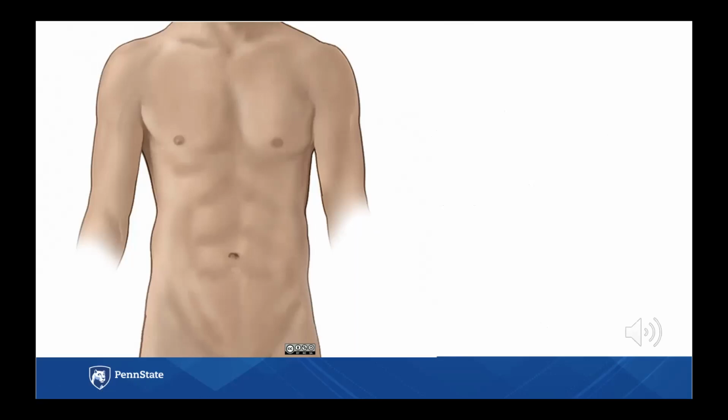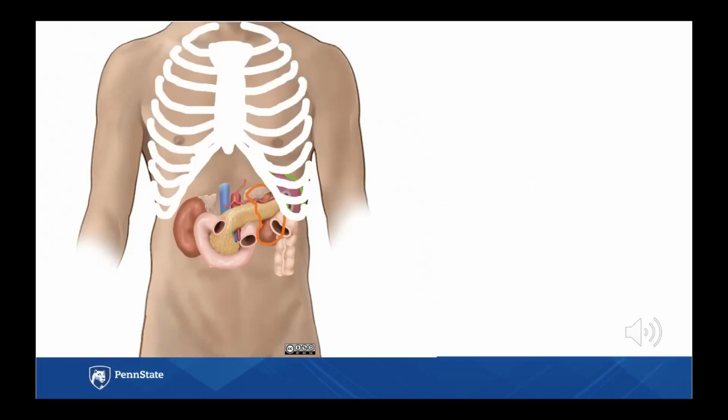This image demonstrates the surface anatomy that you will use to determine proper probe placement. The spleen is located in the left upper quadrant of the abdomen. It is anterior and superior to the left kidney, just as the liver is to the right kidney. However, the spleen is much smaller than the liver, and the left kidney is more superior than the right kidney. So these organs are more obscured by the rib cage on ultrasound exam, which makes it harder since we have to battle against rib shadows when trying to locate these organs.